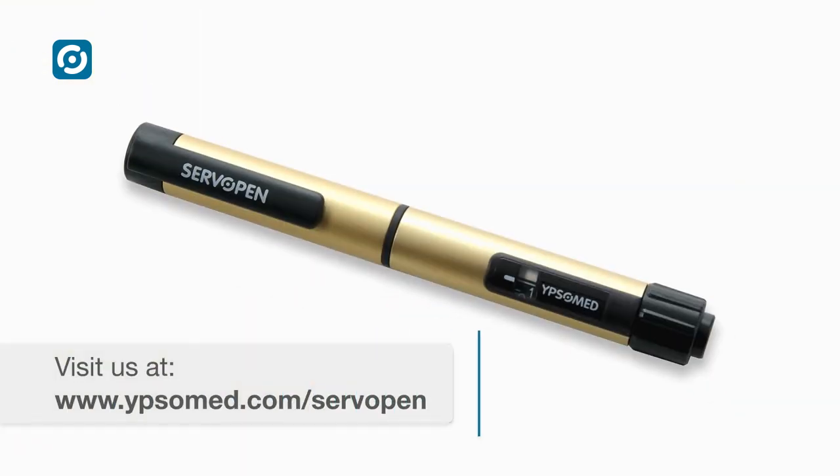ServoPen. The automatic reusable pen for insulin and other pen therapies. ServoPen.